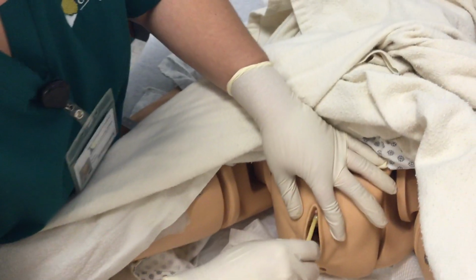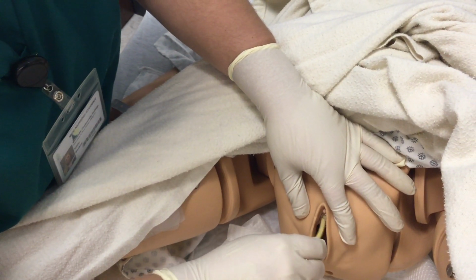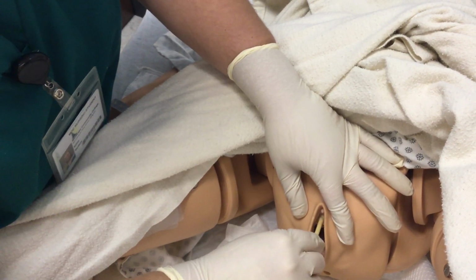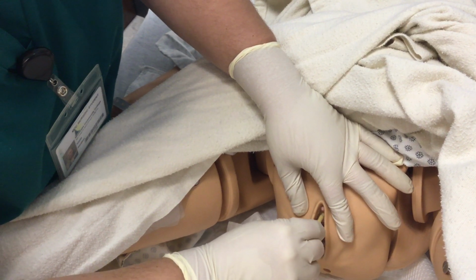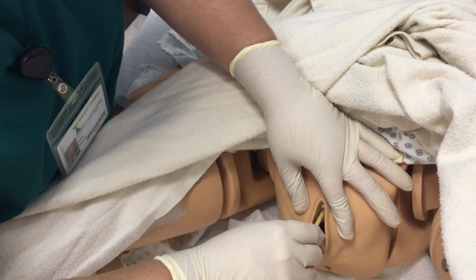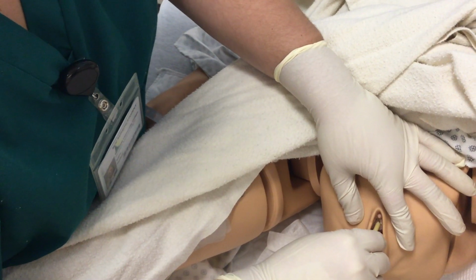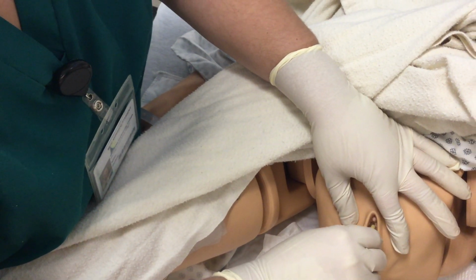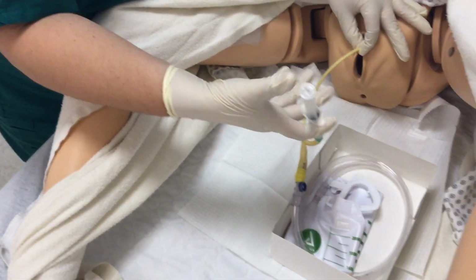Making sure that it doesn't touch anywhere but directly in the hole, and same with my fingers. I would insert it until I started seeing urine. When I see urine, I'd insert it just a little bit more. Clamp it there with that hand.